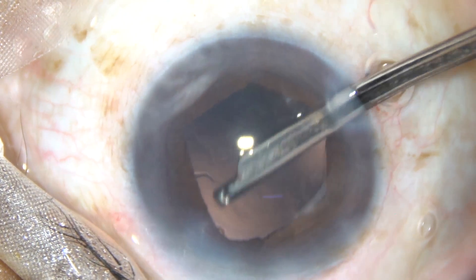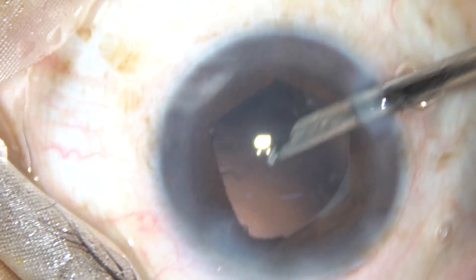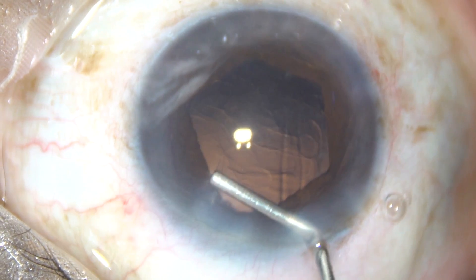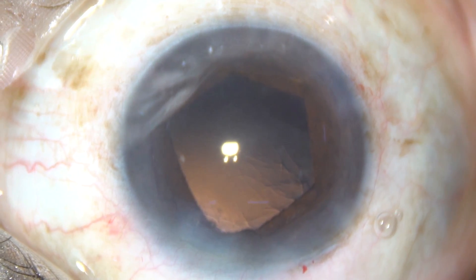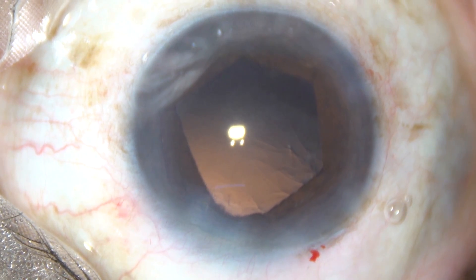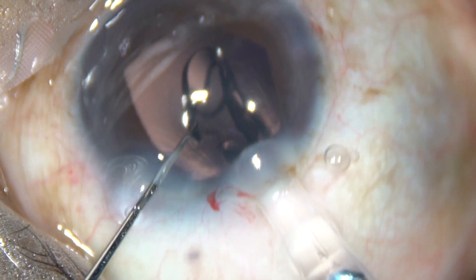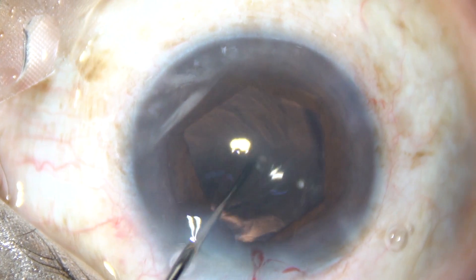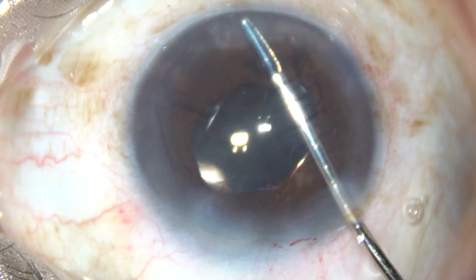It doesn't matter — we still have quite a large pupil and can complete the surgery very comfortably. We need not bring the portion of the flange that has gone behind the iris back above the iris. Viscoelastic substance is injected, then a foldable intraocular lens is implanted in the capsular bag. This is a hydrophilic acrylic intraocular lens, but you can implant any lens — once you have this device, you can even implant a toric lens.